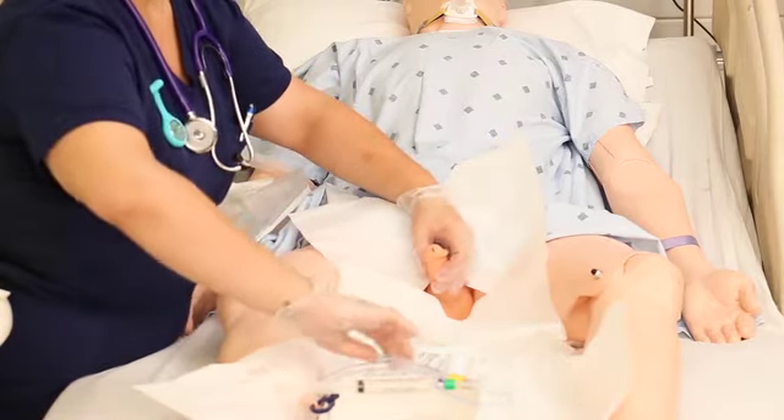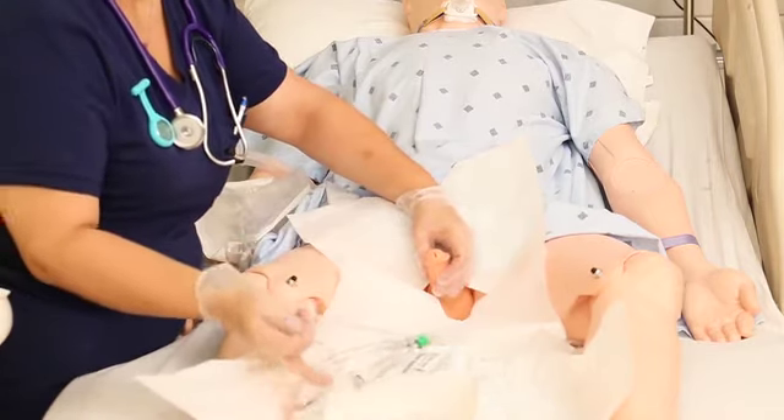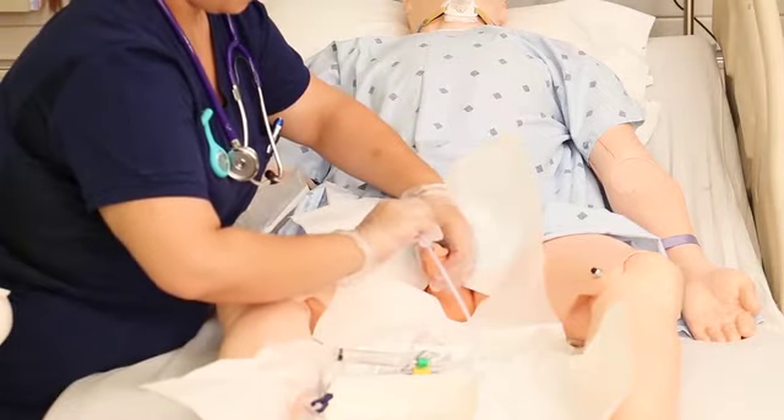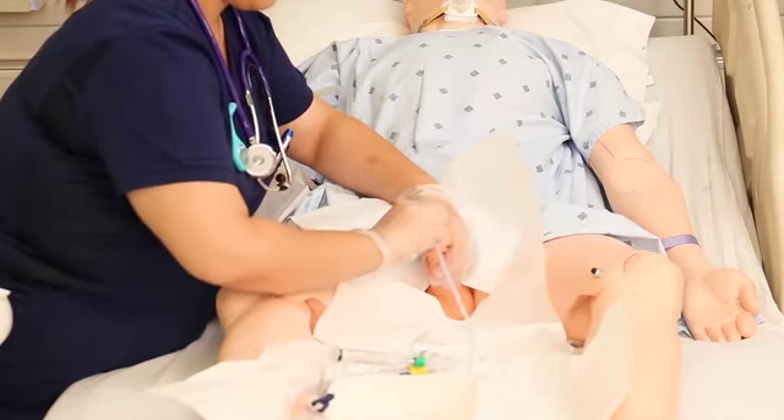Once you're fully clean, it's time to insert. Don't let go with your non-dominant hand — that hand is now dirty. Carefully pick up your catheter and warn the patient they're going to feel some pressure, then gently insert into the meatus.